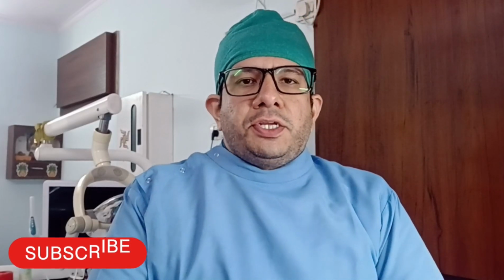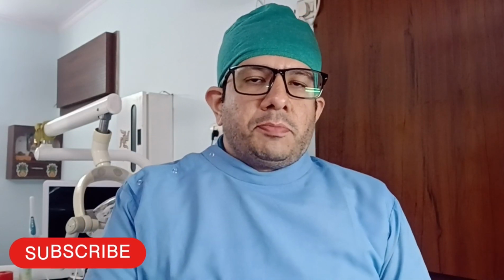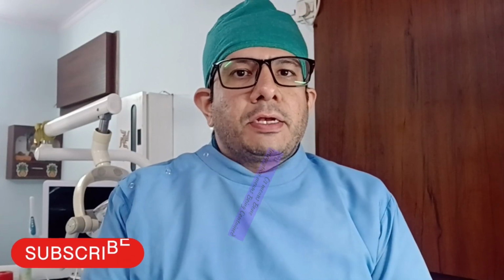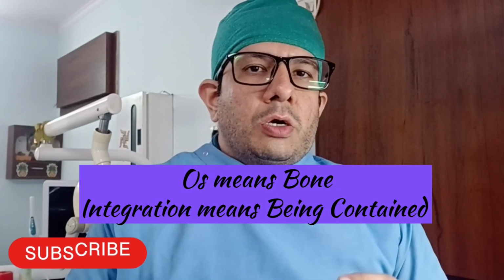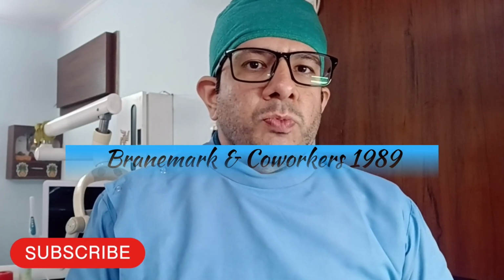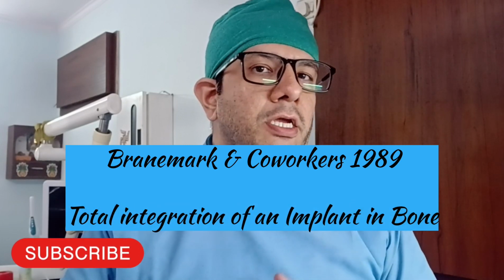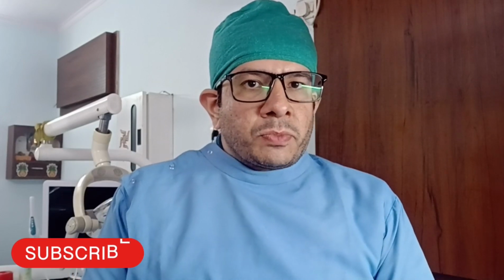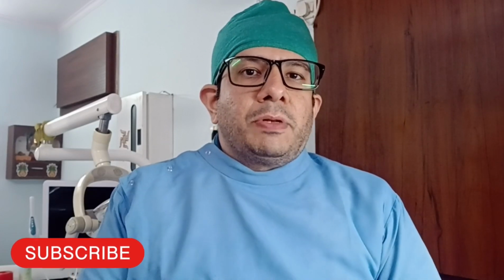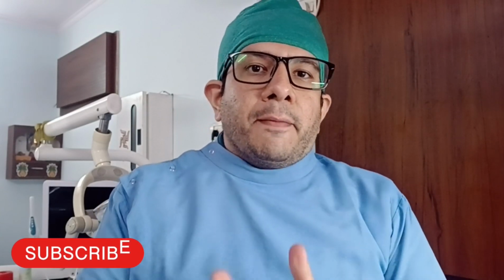So now we are concentrating on the term osseointegration. Osseointegration: os means bone and integration means being contained. According to Brånemark and his co-workers in 1989, osseointegration is defined as the total integration of a dental implant in bone, especially when the bone is healing after the trauma of implant placement. It is also called ankylotic bone.